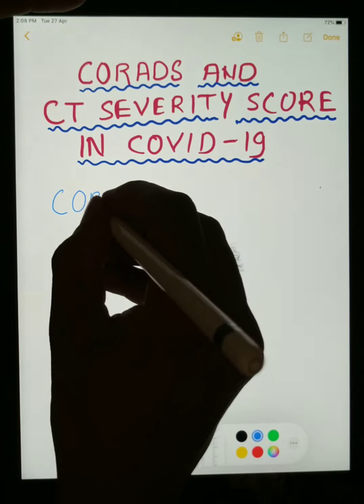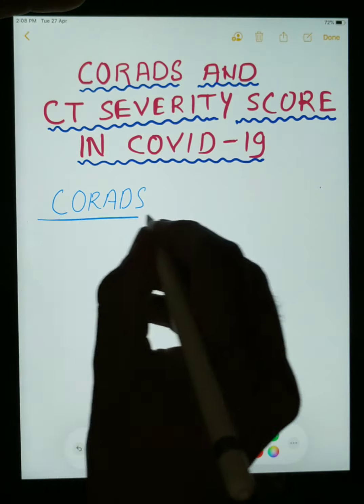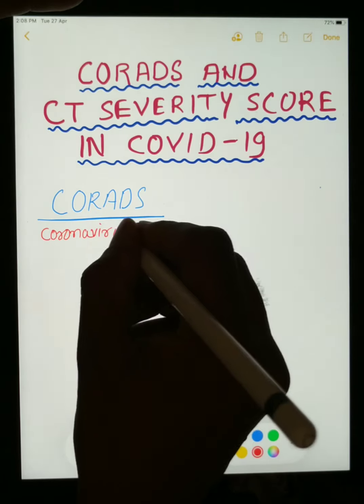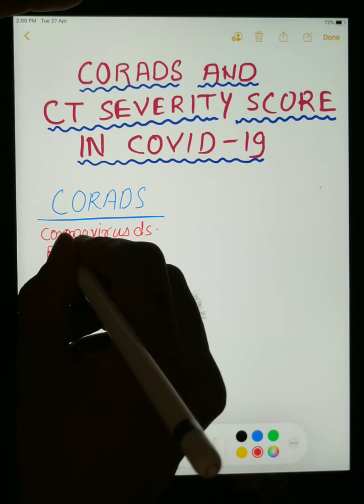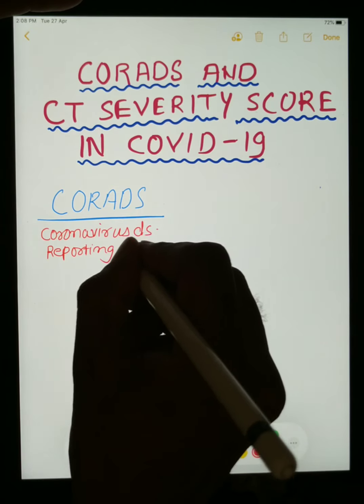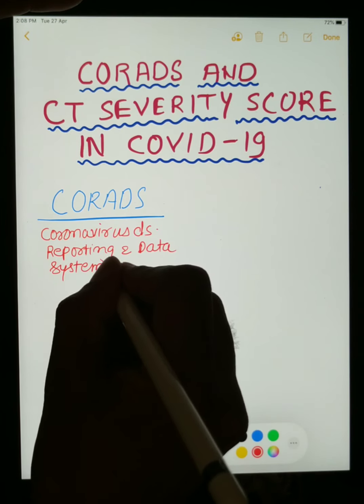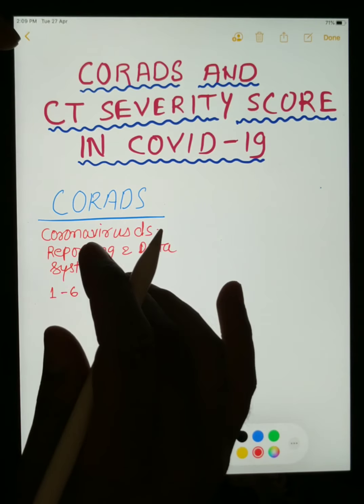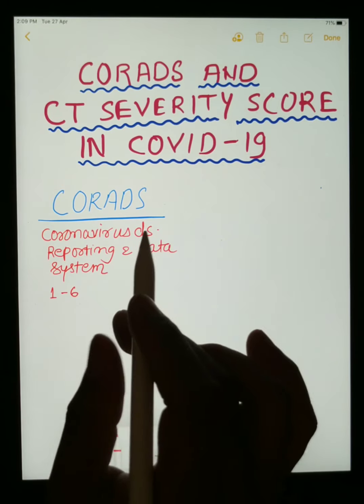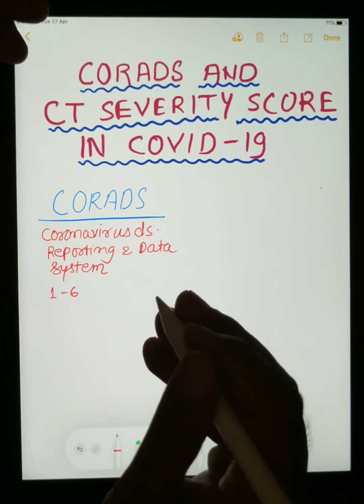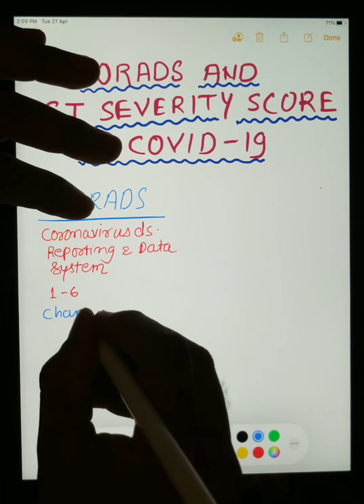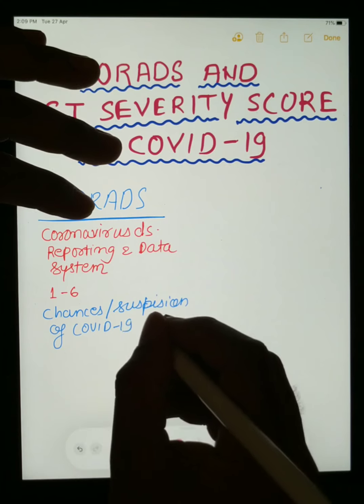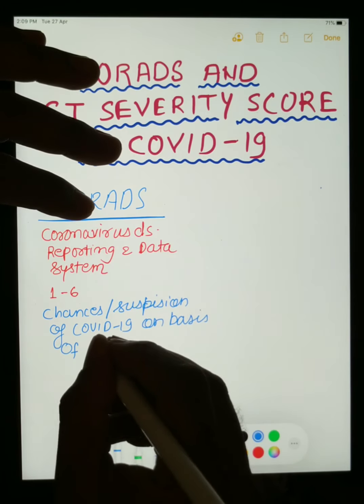First of all, what is CORADS? CORADS stands for Coronavirus Disease Radiological Reporting and Data System. In CORADS scoring, a number is given from 1 to 6. CORADS tells us how much chance of COVID-19 infection a person has on the basis of CT chest findings — that is, the suspicion of COVID-19 based on CT chest findings.